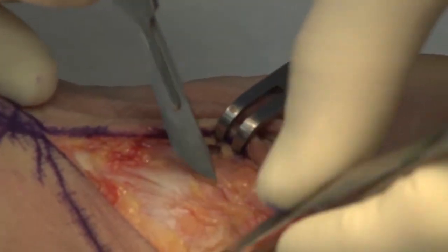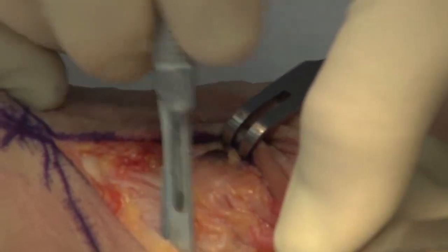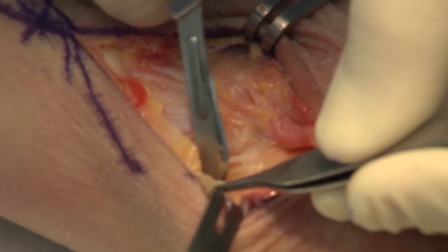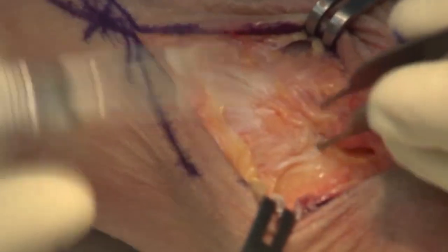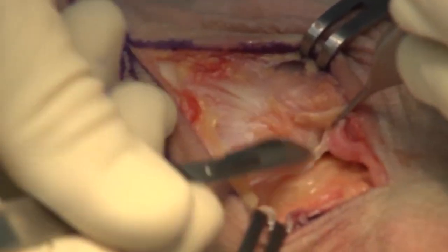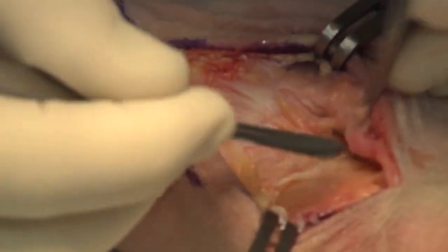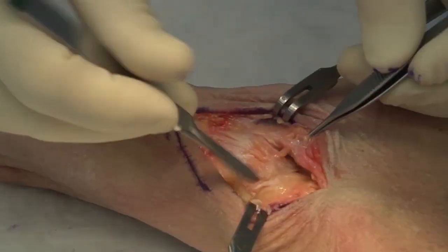This needs to be extended far enough dorsally that you can expose it all the way around circumferentially. By releasing that capsule it allows you to distract that joint much easier, and that's going to be important when you're trying to prepare the joint surface, particularly on the lateral side, which can be hard to visualize.